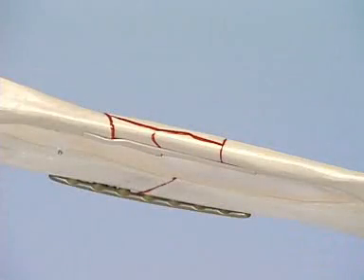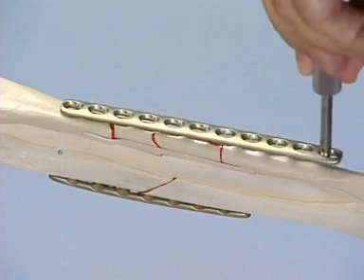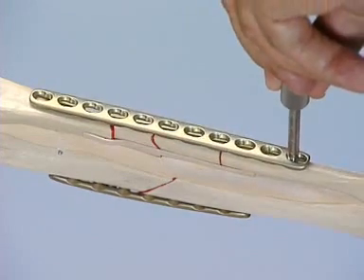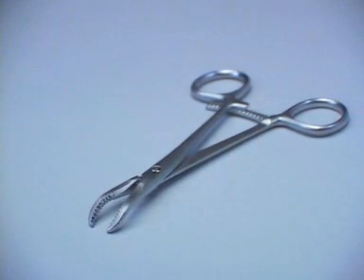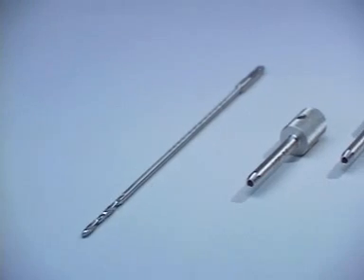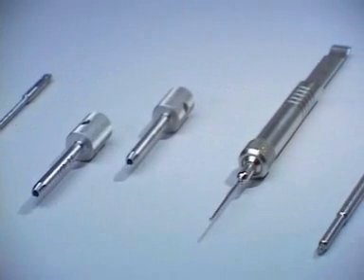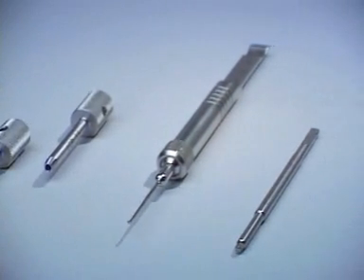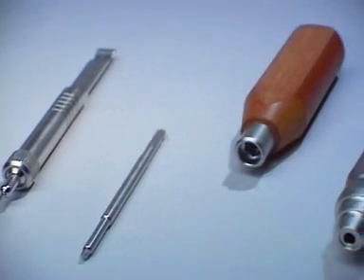The next step is the stabilization of the complex fracture of the ulna using the bridging internal fixator technique with an 11-hole 3.5 LCP. The following instruments are needed: the toothed reduction forceps, the 2.8-millimeter LCP drill bit, two LCP drill sleeves, the depth gauge, and the 1.5 newton-meter torque limiter and its handle.